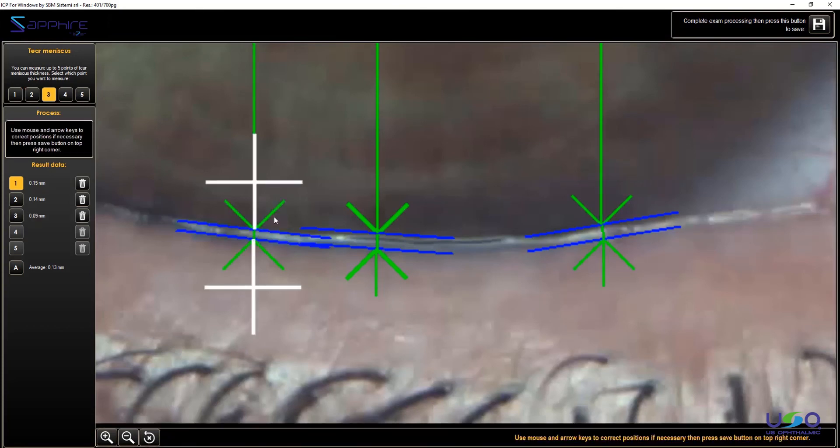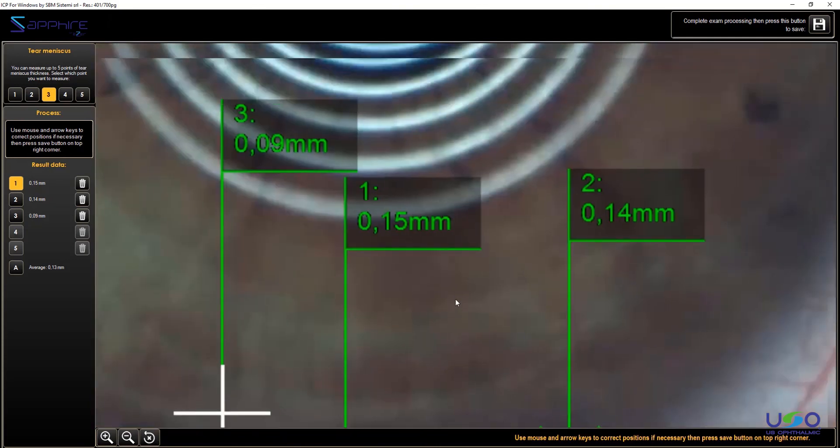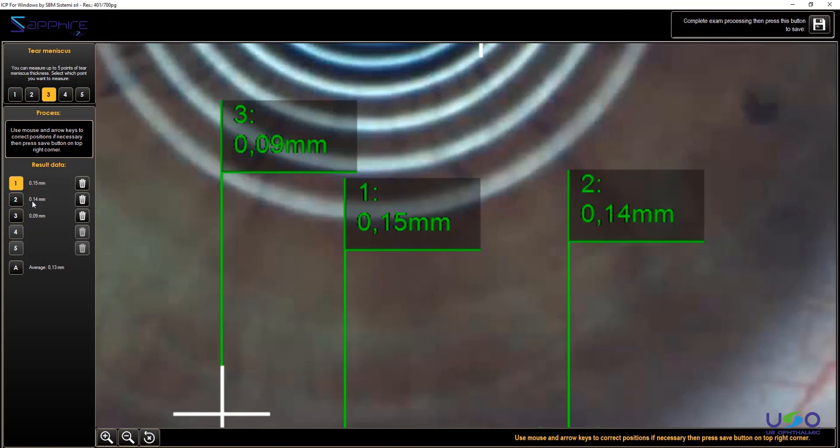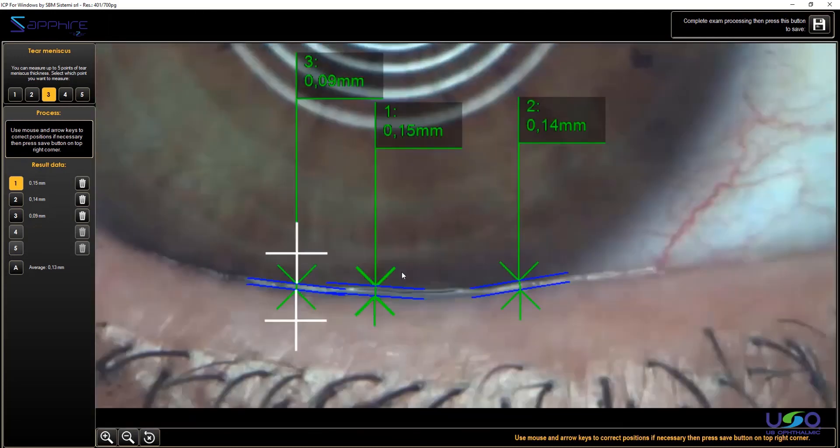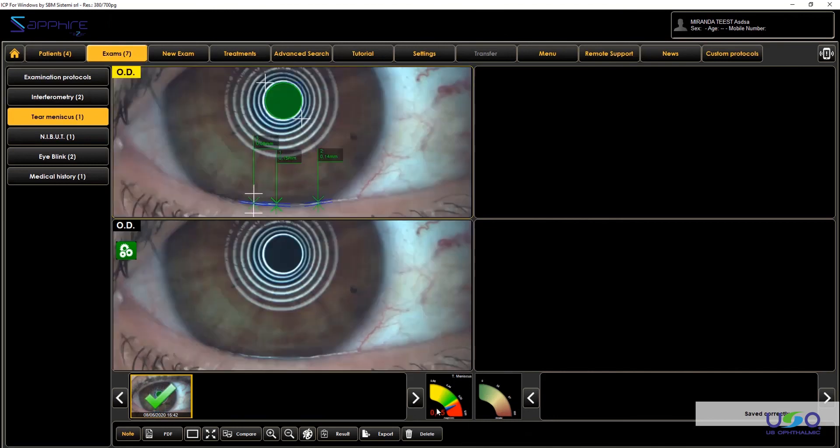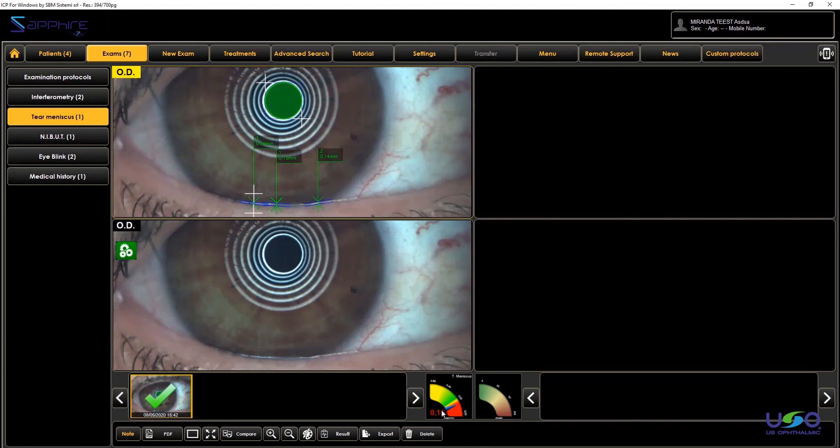So you can set up to five different values, and automatically the software provides you the thickness in millimeters of this meniscus. So now, which value to save? In this case, we suggest to save always the highest value, because we are looking for the maximum capacity of the main lacrimal gland. To look for that, we have to look for the maximum volume present on the ocular surface. So once you save, automatically the software saves the highest value. Even the highest in this case is not enough, so here we are dealing probably with an aqueous dry eye condition.